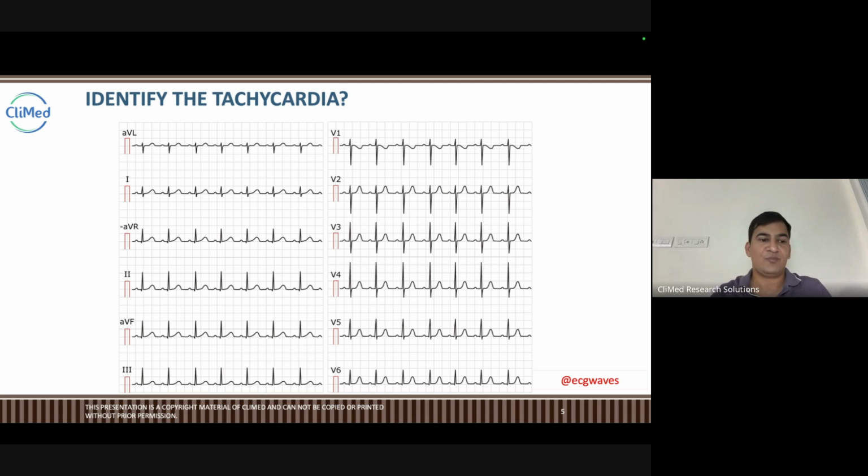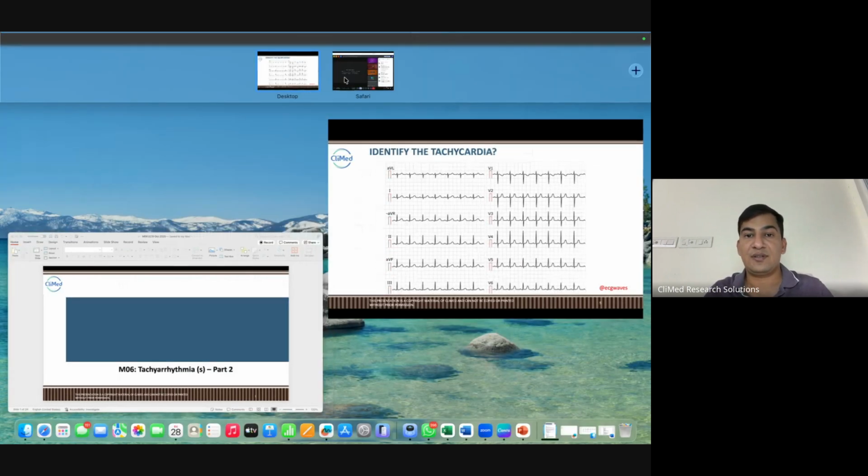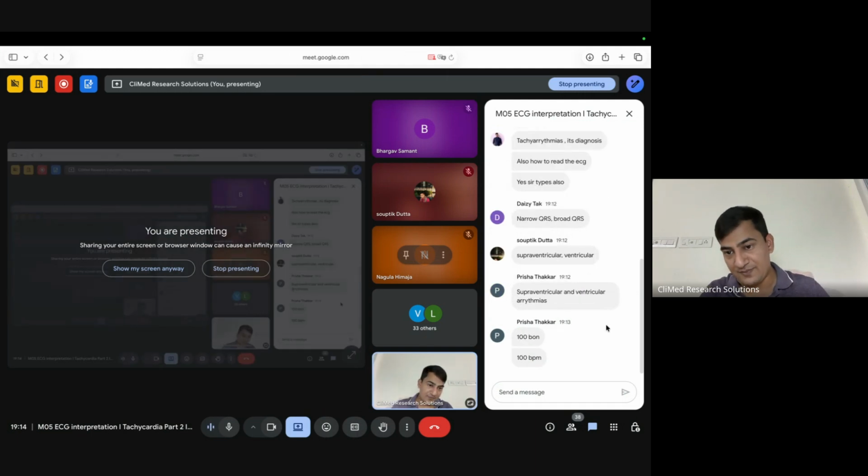Yes, guys, tell me. Fast, fast, fast. Okay, you're answering. 100 BPM.